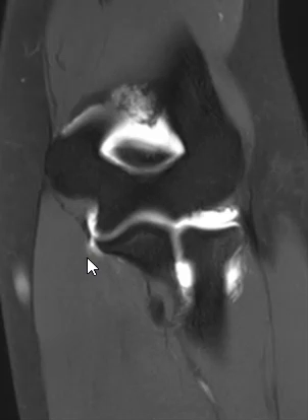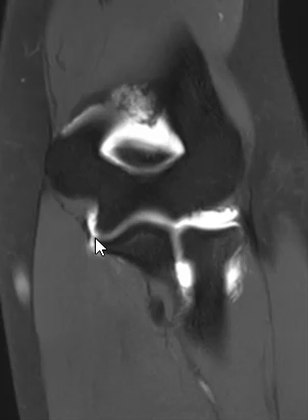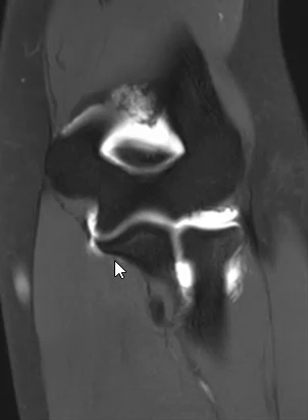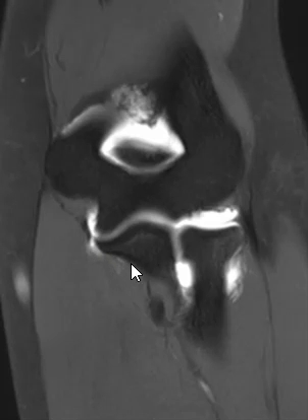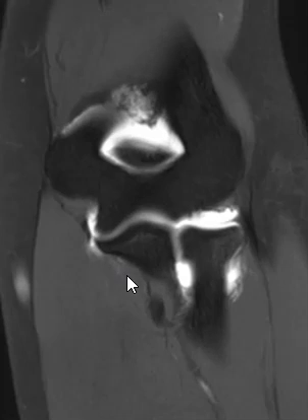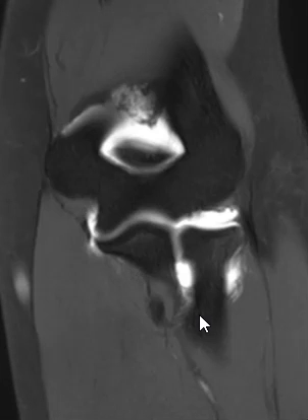UCL, sublime tubercle. More often than this, the UCL will be attached and you'll see just a tiny cleft of contrast. If it's not perfectly smooth and there's a little cleft of contrast there, I still call that a partial tear of the UCL. So this one looks like a full-thickness perforation, allowing for a little bit of extravasation there. Thank you very much.